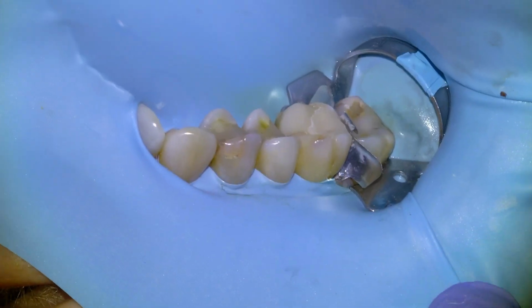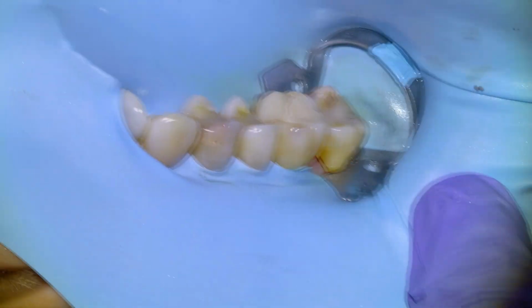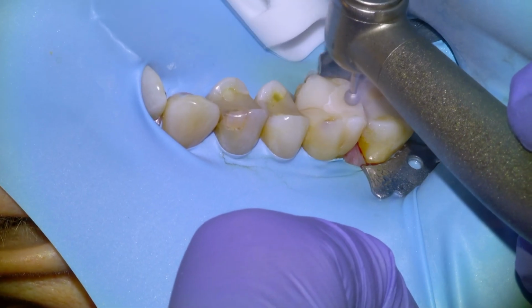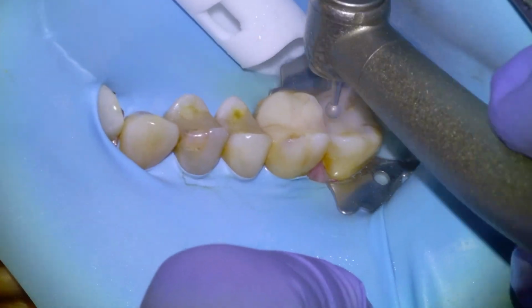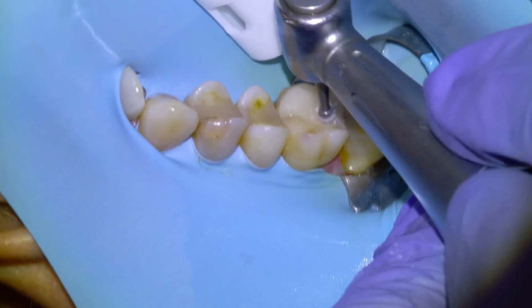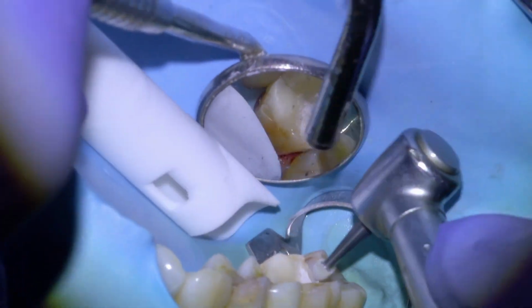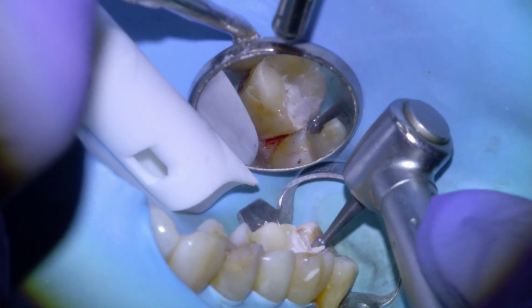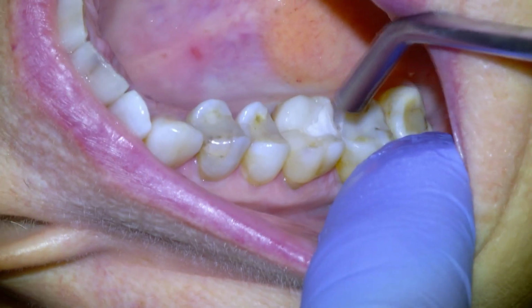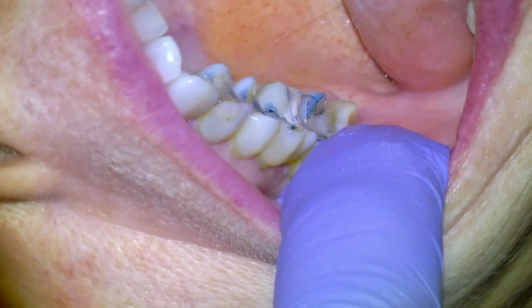And I'm gonna remove the sectional band with some Howe pliers like I always do, and then begin reducing the excess restorative material with a large round diamond burr on a high-speed handpiece, and then refine our reduction with a carbide burr on a slow speed until we're back on the original margins. And there we're pretty much happy. Gonna remove the dam and check the bite. And we're pretty much good to go there.